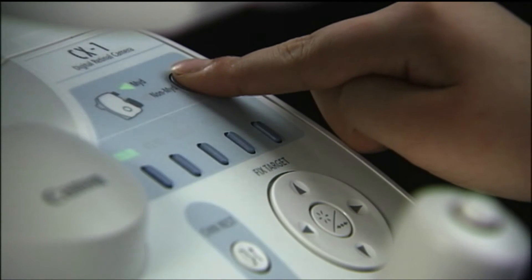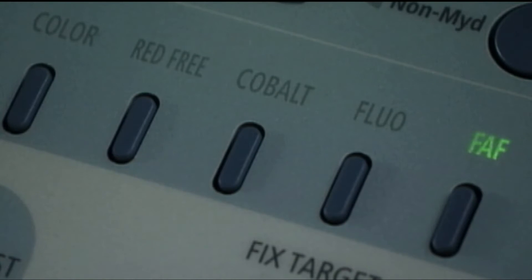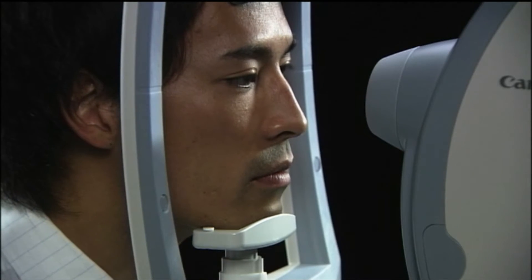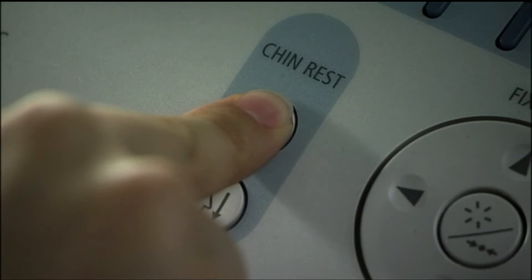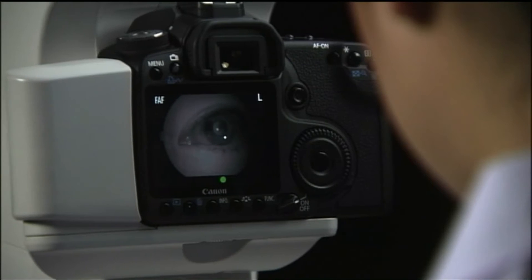First, select the imaging mode for the examination. Then, adjust the patient's head position to align the height line with his or her line of sight. Next, perform a rough alignment using the anterior eye image.